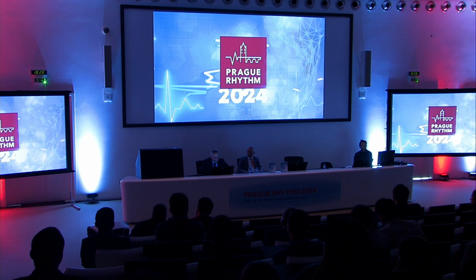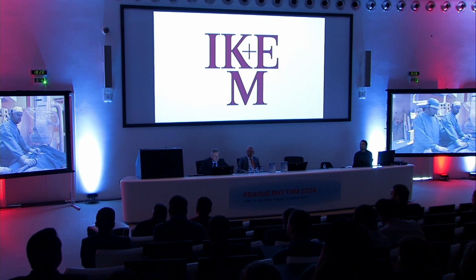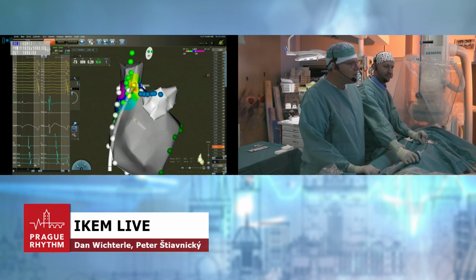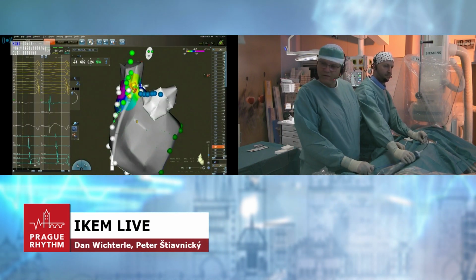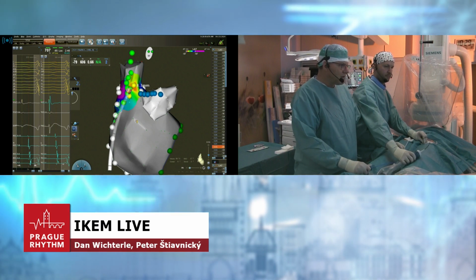So we will follow what Dan did in the other lab with inappropriate sinus tachycardia. Dan? Can you hear us? I can hear you. Can you hear me? Ready for you. Can I start speaking? Yes, it's yours now. All right.